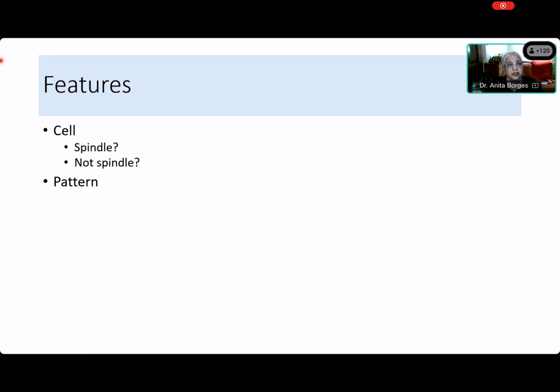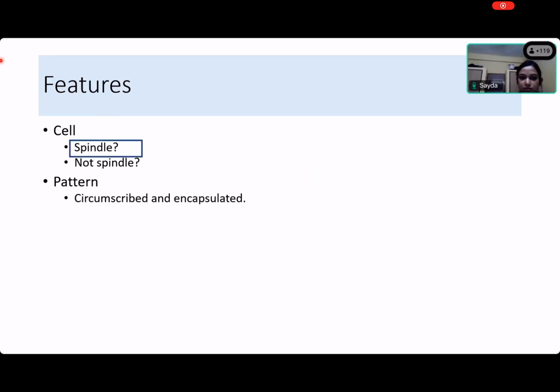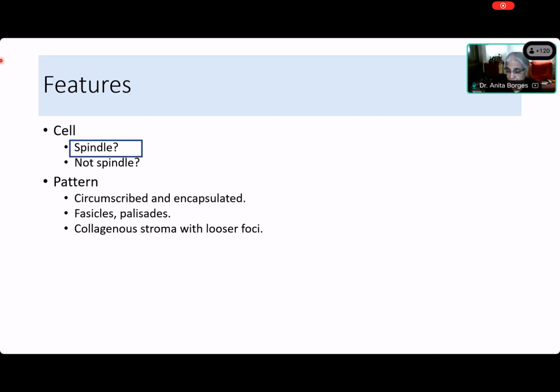Come on, Saida. Is it a spindle cell? Yes, ma'am. Yes, very good. What is the pattern? It is circumscribed. It is encapsulated. And there are fascicles and palisades. Yes. There's collagenous stroma with looser foci, which we refer to as Antoni B. And what is the cellular content? Spindle cell. Yes, very good. So what do we do next?